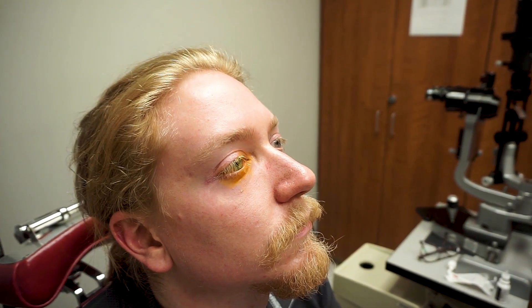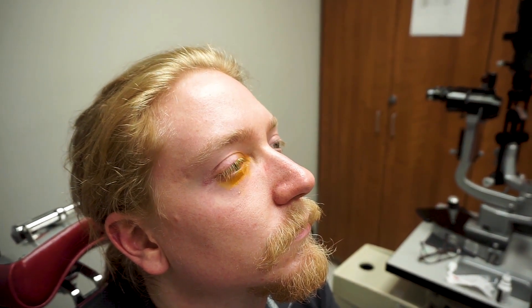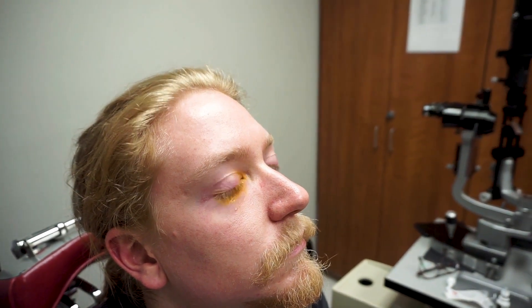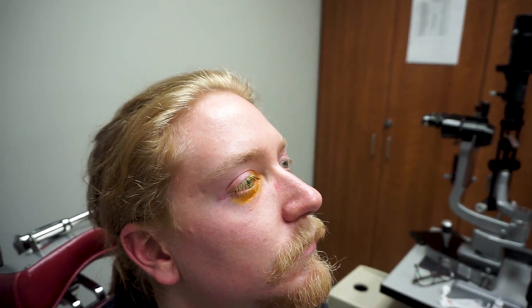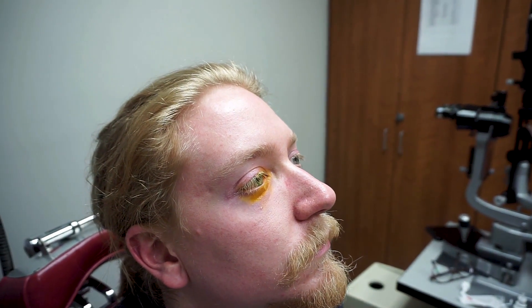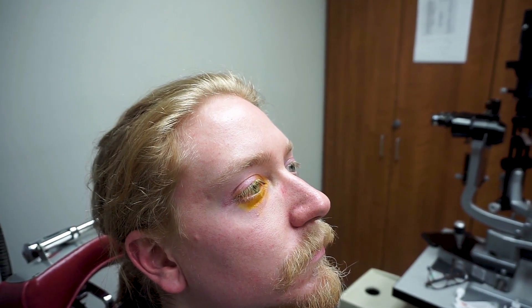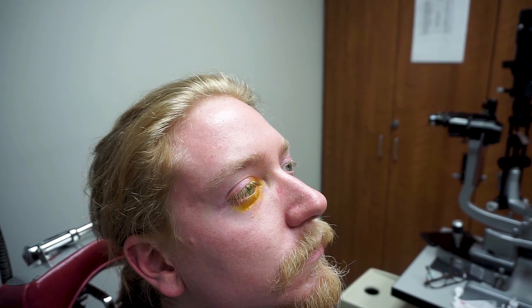Now ask the patient to blink multiple times to allow the stain to distribute evenly across the surface of the eye. A common mistake is placing too much fluorescein into the eye, which causes the entire tear film to become illuminated. This makes it difficult to visualize small lesions.